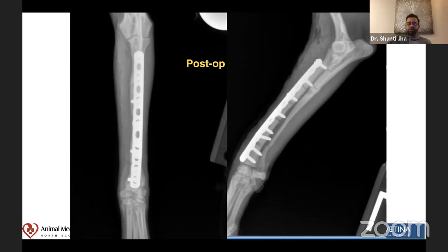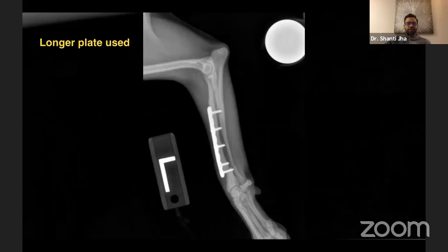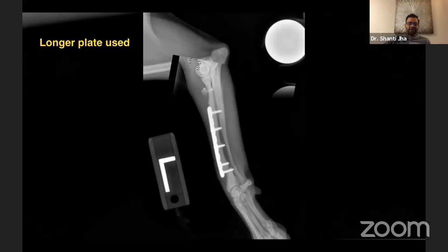There's no need to. We can discuss a little bit more basic fracture repair and physics later. This is 8 weeks post-op, healed beautifully. Dog is doing its normal thing and making the pet parent happy. So what did I use? A longer plate. So let's learn from this example. Again, not a surgical technical error, but I should have definitely used a longer plate. And I can argue that the dog was small and then the dog grew and hence the plate became small and it fractured. But anyhow, that was post-op.